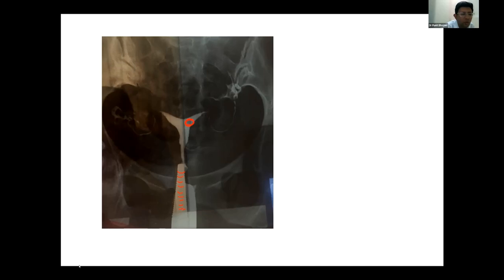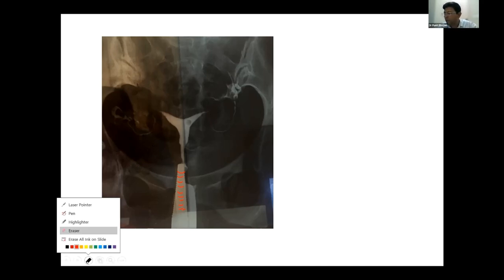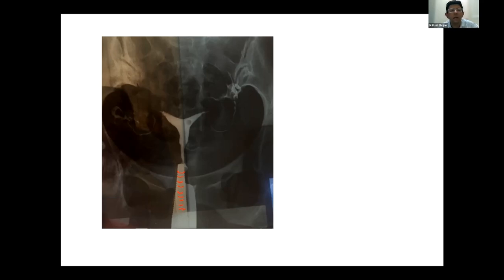Okay, is it clear to all of you? You are supposed to say right now only, we cannot say polyp, what it is. According to me, I agree with you that the uterus is looking a little arcuate, but more than that, arcuate or subseptate is difficult to say. Yes, there is a fundal indentation, but I don't think it's a block because I can see the dye and the spill over here. So I wouldn't say it is a cornual block or a tubal block, but the most striking abnormality.